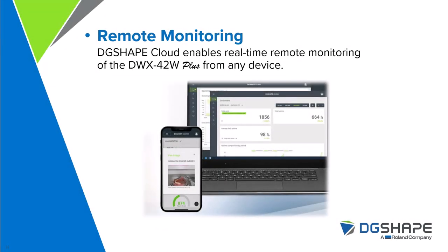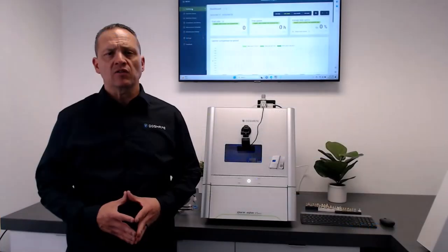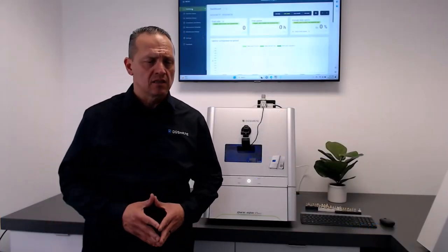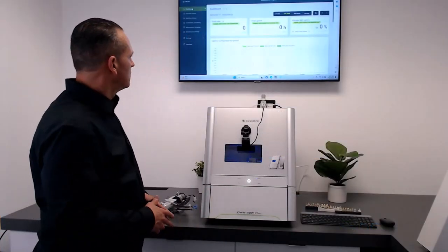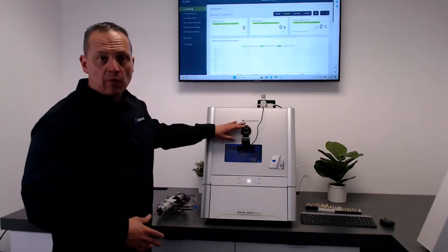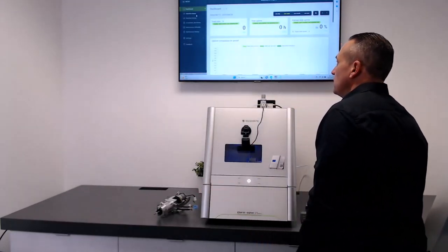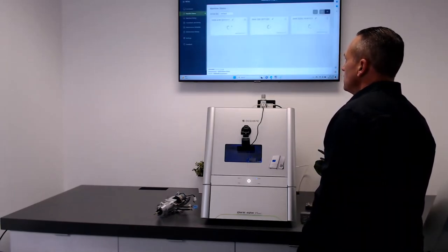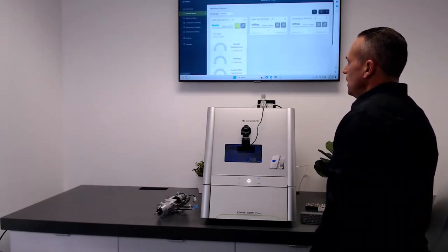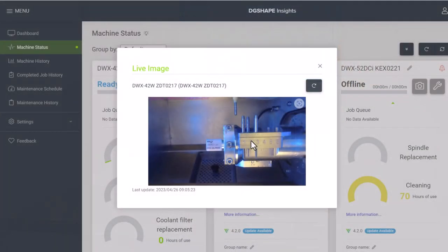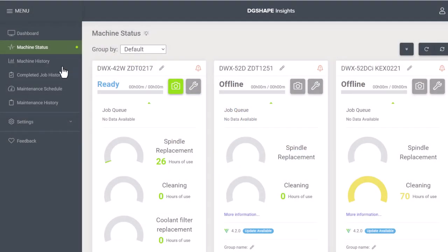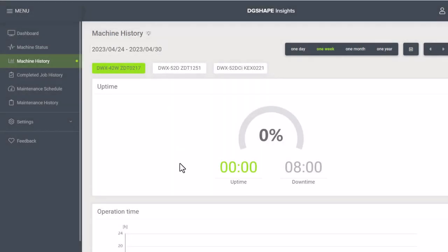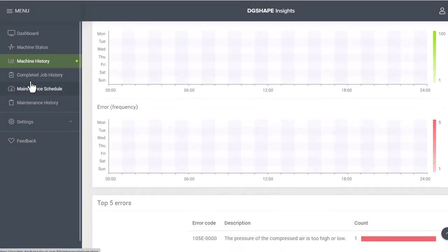DG Shape Cloud enables real-time monitoring of the DWX42W Plus from any device. Also you can add a camera so you can look at the device as it's running, from machine status, locate the device, and you can locate the camera.